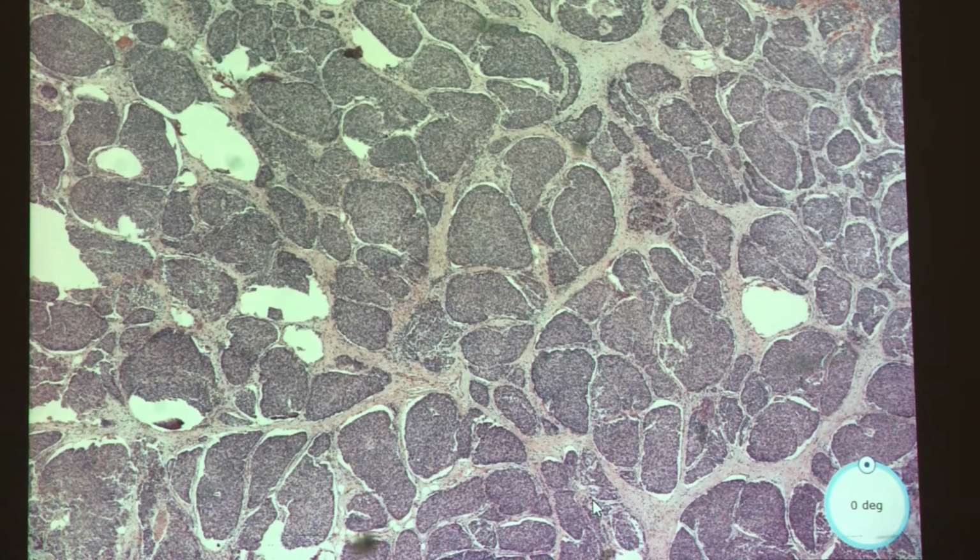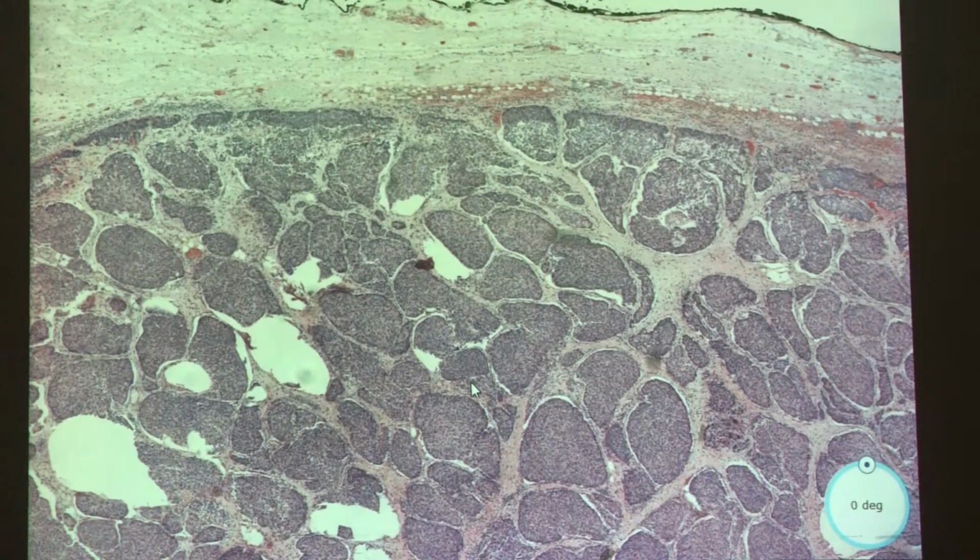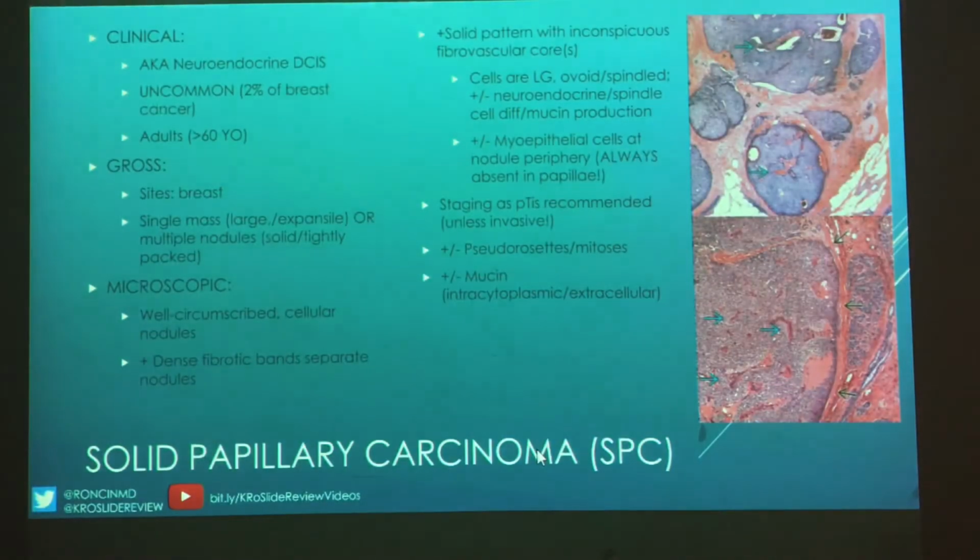I know you did a little bit of reading about these and a little bit of learning about them. So are these good tumors to have or bad tumors? I did not get to that, but I'll say good. Yeah. So these are relatively indolent. Excellent guess. 50-50 shot. Hey, you can't beat that. You're 2 for 2 right now.